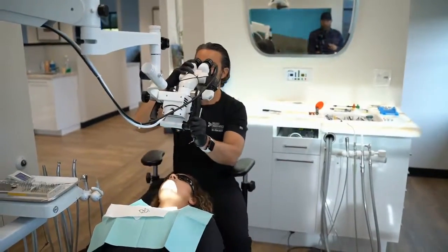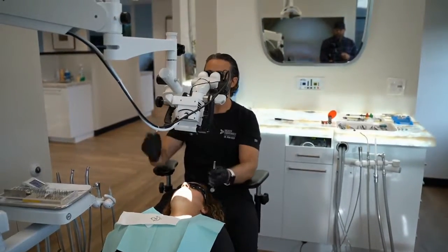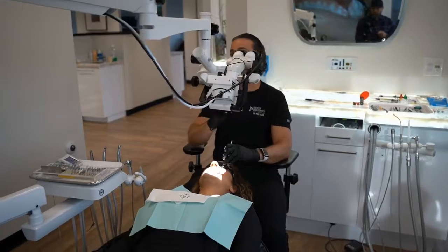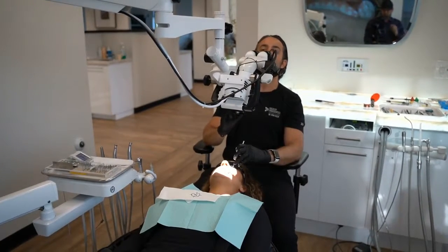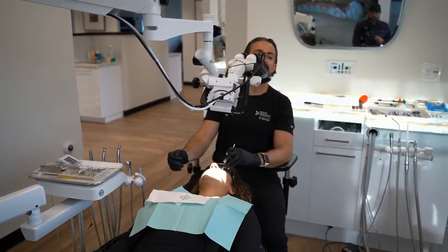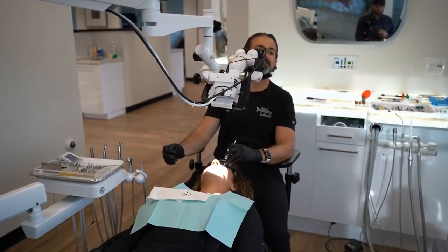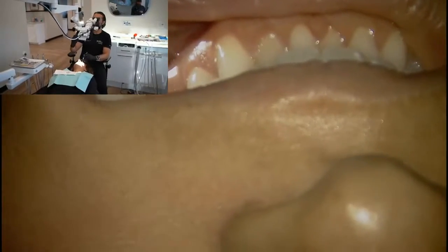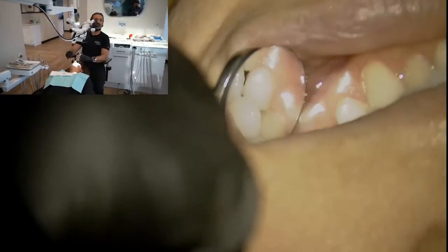If I'm in 12 o'clock and I'm wanting to look at that facial surface, then obviously I'm doing it indirectly with the mirror, and I'm coming in like that. And then I'm just working in the mirror like that. Except you guys aren't showing what I'm seeing on screen. Like that.